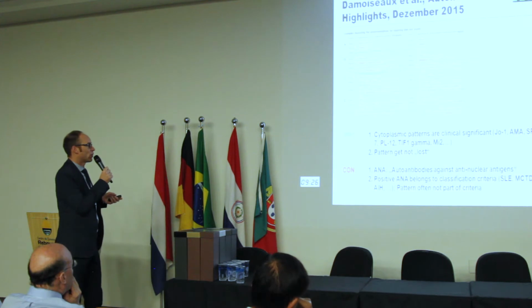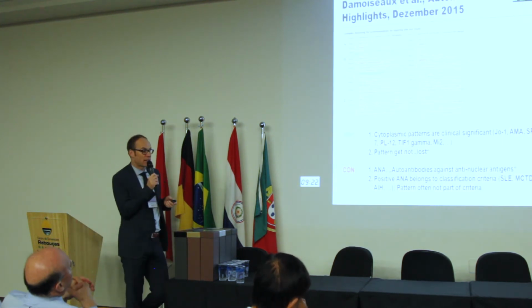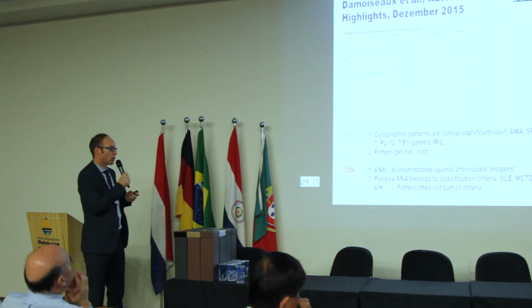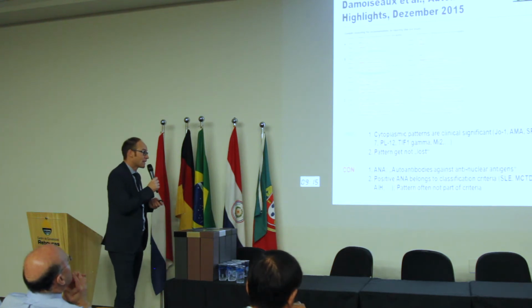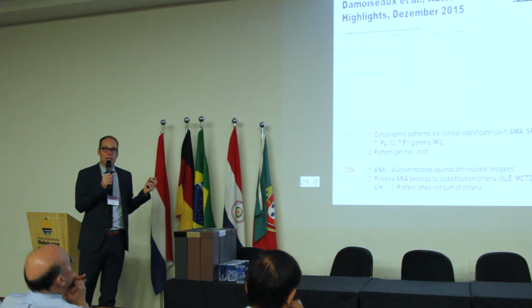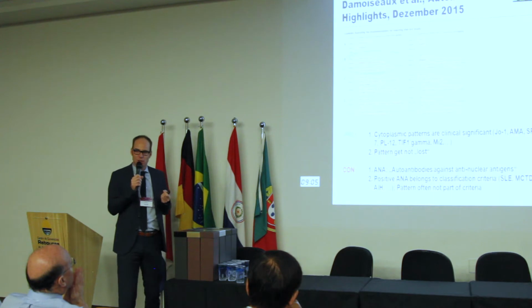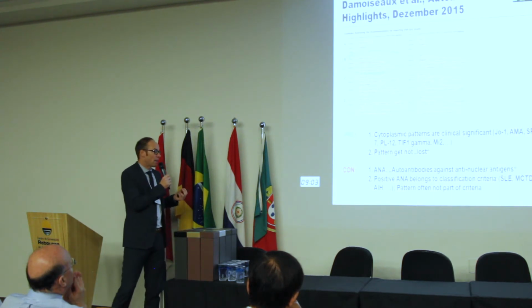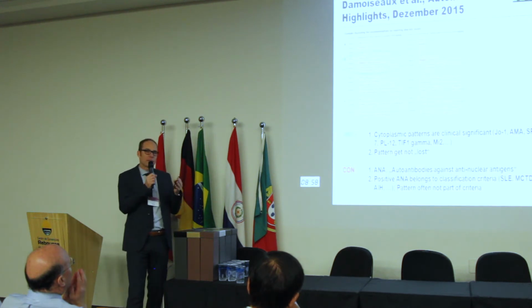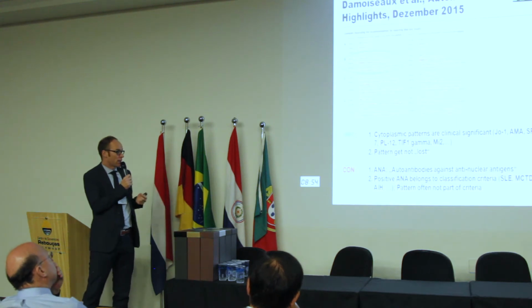Of course, there are also a lot of pros, because cytoplasmic patterns are really significant, mainly in myositis, so Jo-1, and nobody normally doubts that Jo-1 is an important pattern, but also others like mitochondria, SRP, PL-7, PL-12, TIF1-gamma, Mi-2. They all have a pretty low prevalence, but normally you don't have double positive cases. So if they are positive, they are really highly specific, and you can get a better prevalence if you take all these different patterns into account.